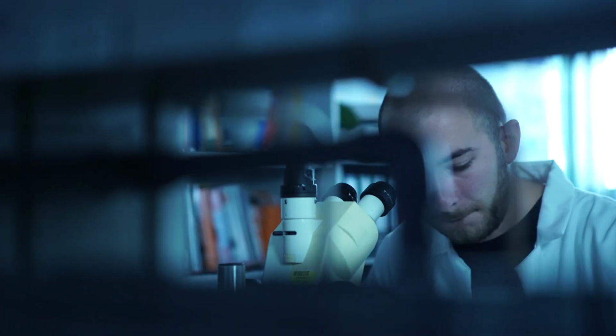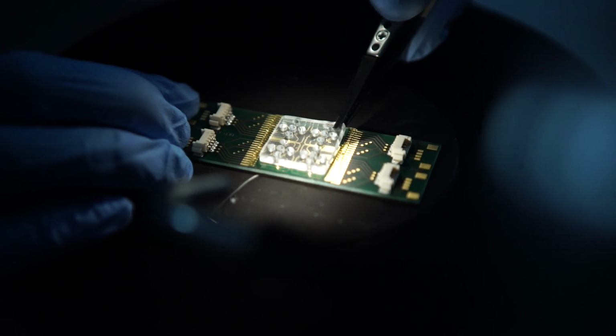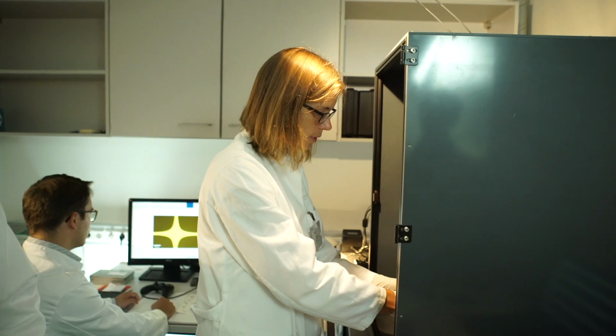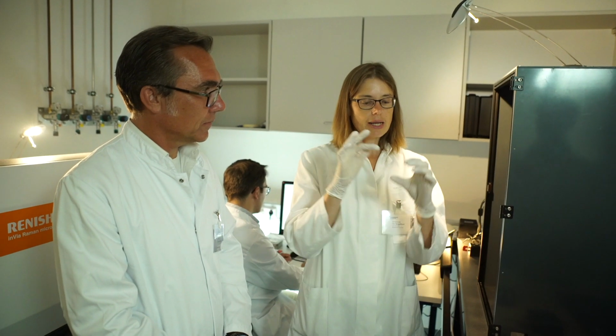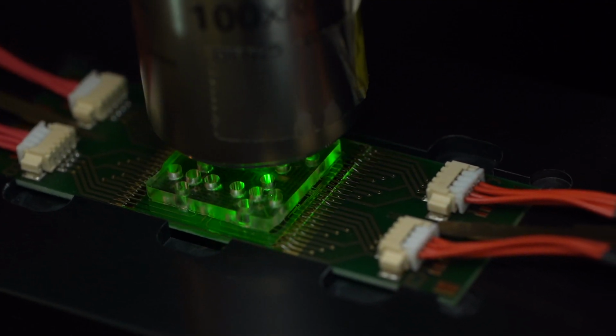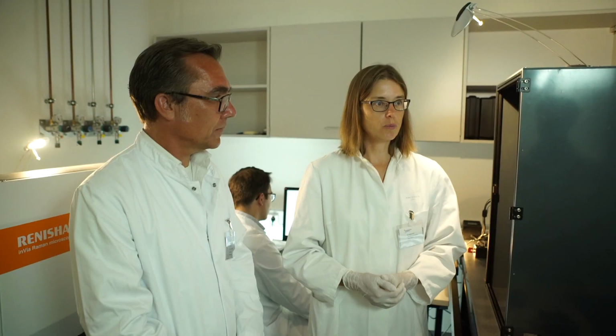To achieve this, the researchers in Jena have combined classic microscopy with biophotonic methods. I place this under the microscope, switch on an electromagnetic field. The bacteria, which are scattered in small amounts throughout the sample, are rounded up until they are all gathered at the center. Then we can expose them to the laser beam, collect the backscattered light, and analyze it using statistical procedures. After 3.5 hours at the very latest, we know whether the bacteria are sensitive or resistant to the selected antibiotic.